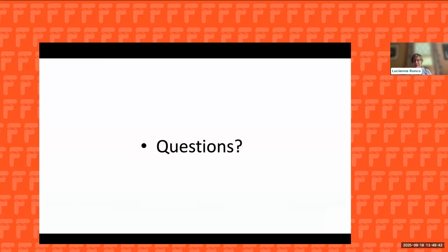All right. Well, thank you, Seth. You took us from soup to nuts on MRI. And I want to go back to soup a little bit. I'd like to go back to one of your basic premises that was important all the way through your talk, just to be sure that folks understand that premise. And that's about the concept that the pattern of fat in a muscle really matters and affects the progression, perhaps the rate of progression, perhaps it predicts progression, and that's essential. So that's a really key message to come out of this.